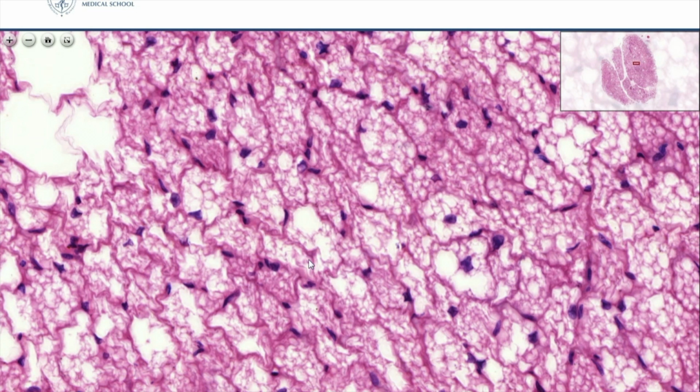Non-shivering thermogenesis is important to keep the body temperature, so it's most important with newborns and small children. They have proportionally a little bit more of the brown fat tissue, but adults have it also in the interscapular region in the middle of the back, in the mediastinum, that's the posterior region of the chest cavity, and also in the fatty capsule of the kidney. You might find brown fat tissue also in adults.